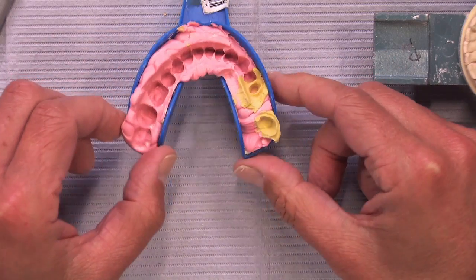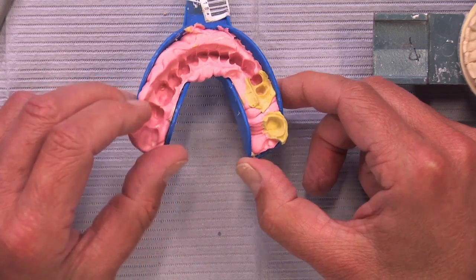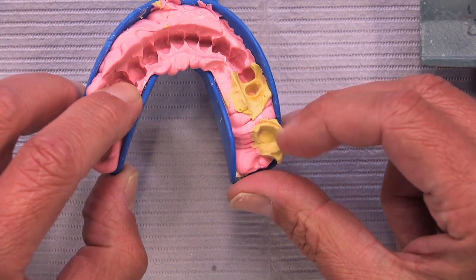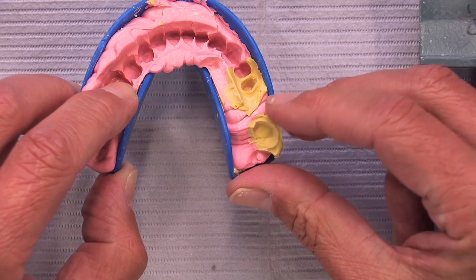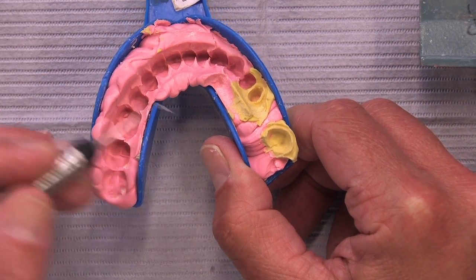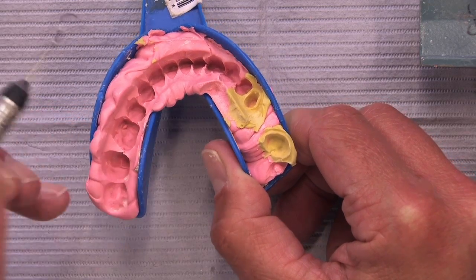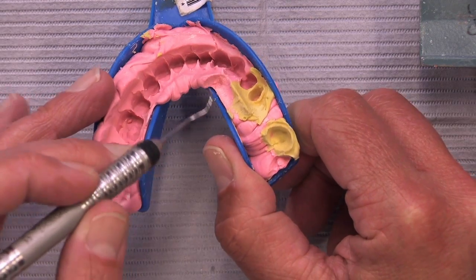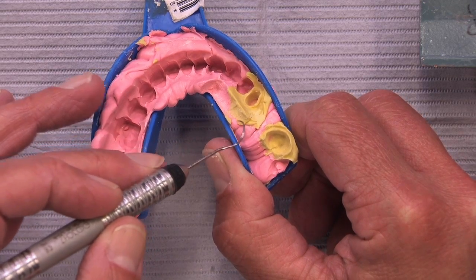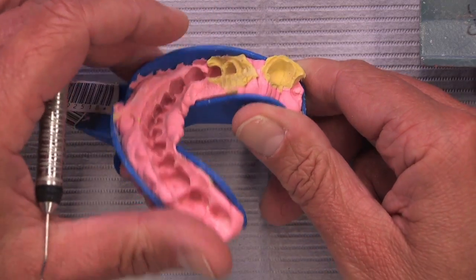But we can complain a little bit about the impression itself. We've got our one material that's been used here as kind of a pre-impression, and then we have the yellow that looks like it was done separately. You've seen me many times go in and kind of peel this apart. You can always tell when looking at these impressions whether or not these two materials set at the same time. And it's something we've harped on before because it peels apart and it just never is as homogeneous as it would be if these two materials set at the same time. So we can be a little critical.